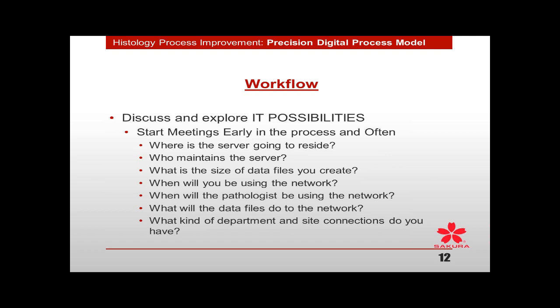And how will you be using the network? This is a big one. Even if your pathologists are across the hall from you, you're going to be using a network to deliver all of this digital information. You can quickly shut down the network with digital scans.